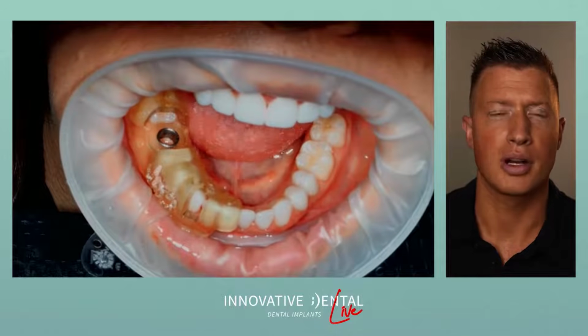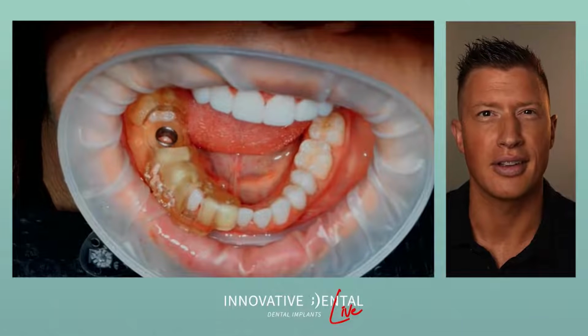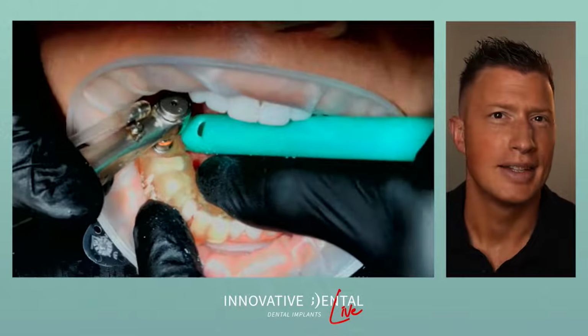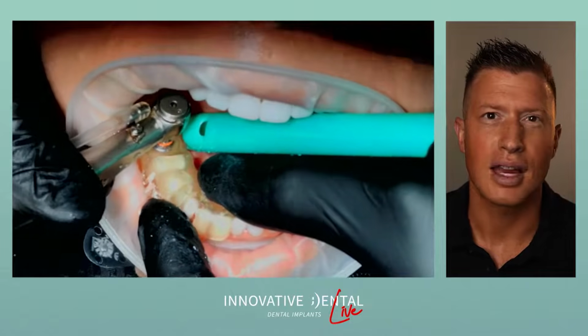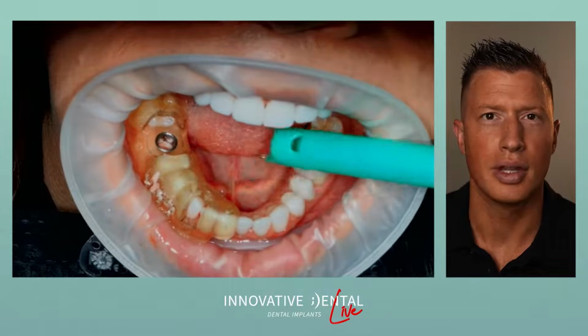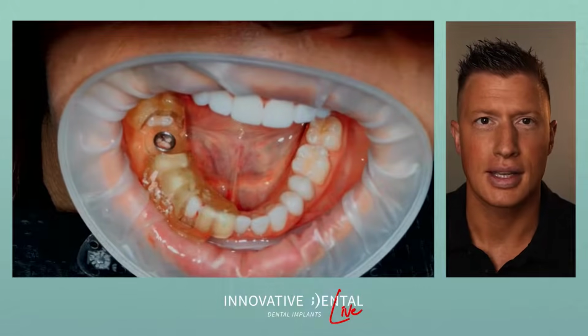Probably the worst part is staying open for 8 minutes or so here. 8 to 10 minutes. I'd say on average, guided implants take maybe 7-8 minutes is kind of the going time period for that. So it really doesn't take very long to get an implant.